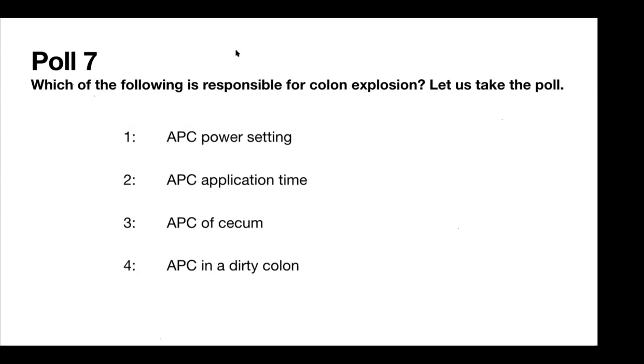People talk about that as a measure, but I say to myself, if there is radiation proctitis or radiation telangiectasia and you want to do APC, it's probably safer to just go through the whole prep rather than giving them an enema and then trying to do CO2, because you can't go all the way up to empty the whole colon. So I don't know.